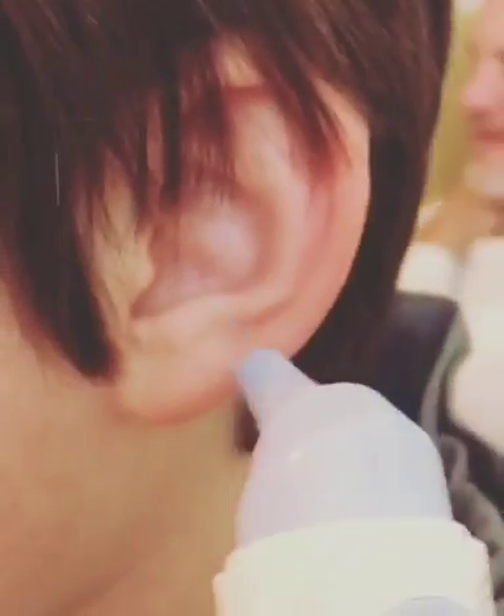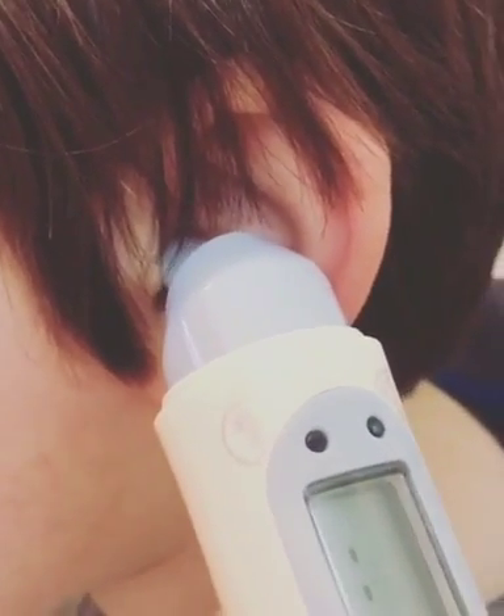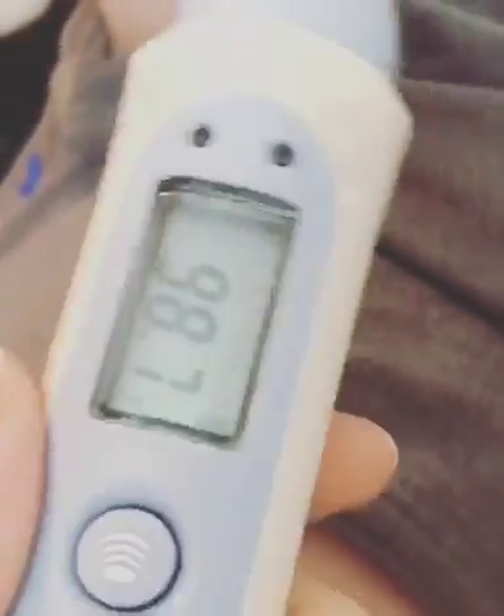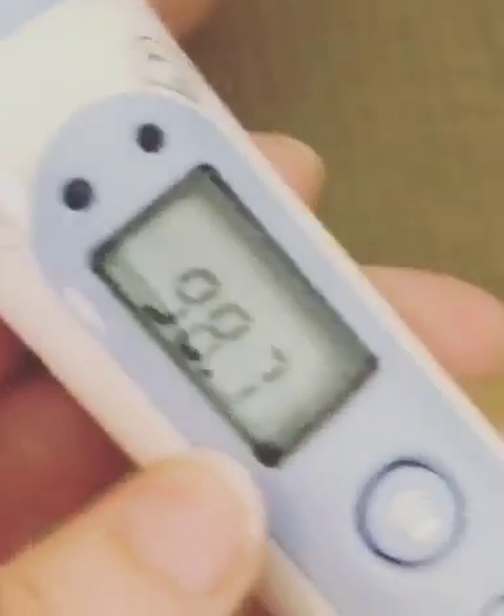And so let's do your ear. I don't think I can do this — I'm trying to do it one-handed so it may come out a little different. All right, that's pretty close, 98.7. So that's how I use it, it's pretty neat. Yours is always hot. It came with an extra battery, which is nice, and that's about it.